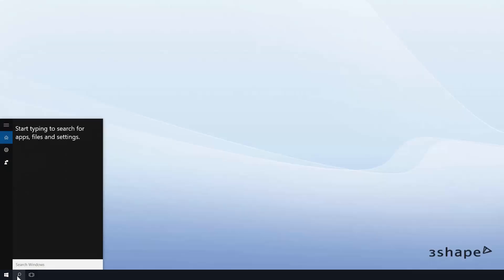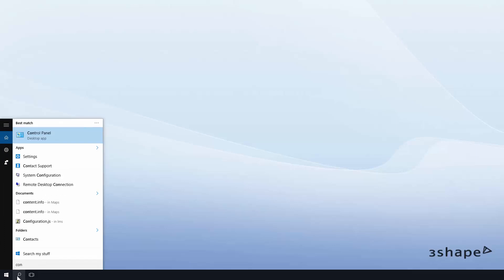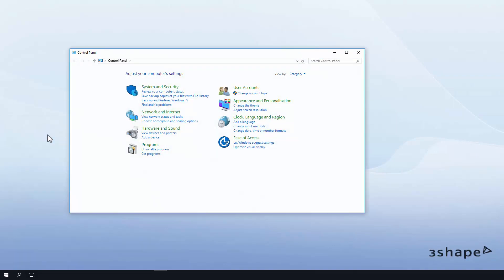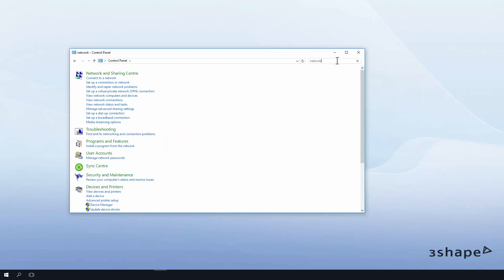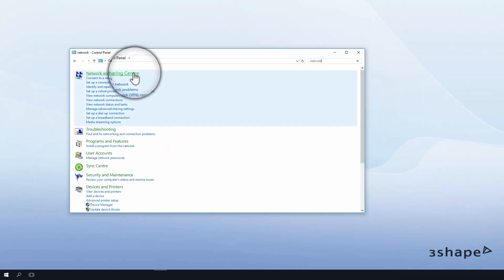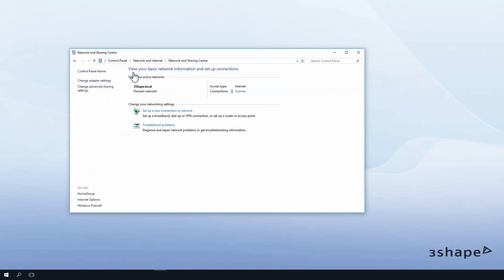Firstly, change your network discovery settings on all your PCs to see other computers on the network. Type "network" into the search box in the control panel.